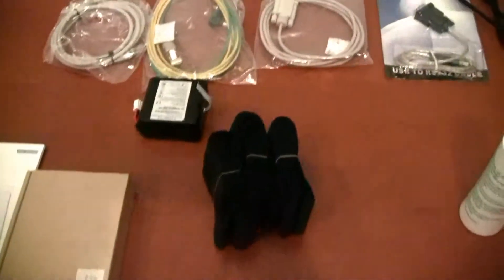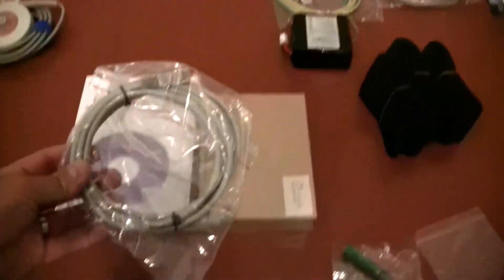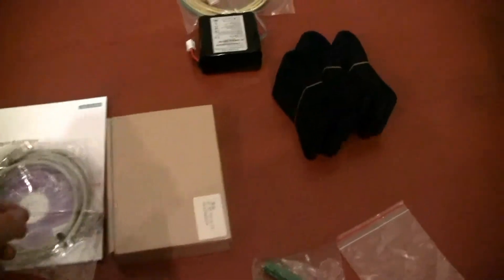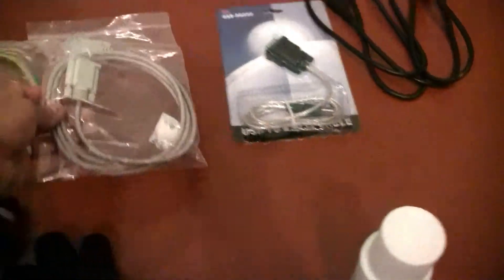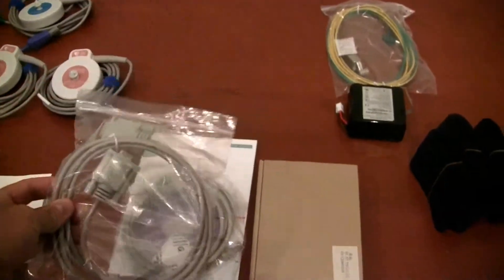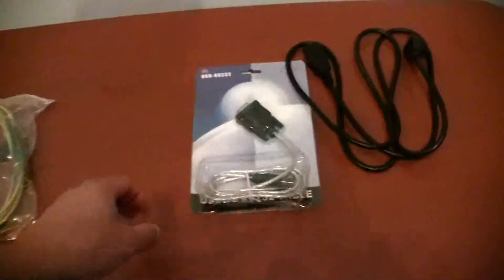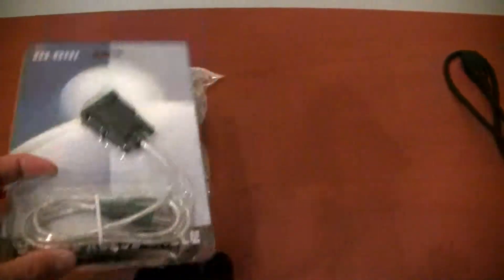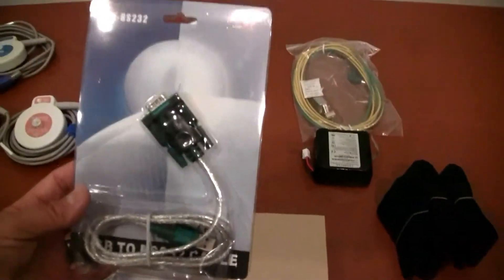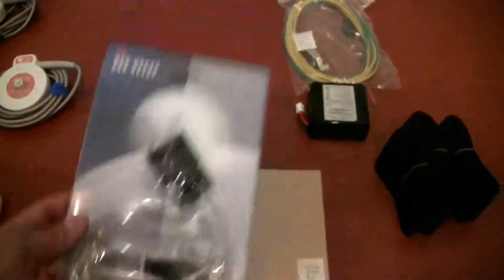We even include the cables necessary to network the device to a computer if you're going to run the software. This is a standard Ethernet cable. There's also an RS-232 cable that connects the device to a computer. And if you don't have an RS-232 jack on your computer — for example, if you're using a laptop — we also include an adapter to convert RS-232 to a USB connection.